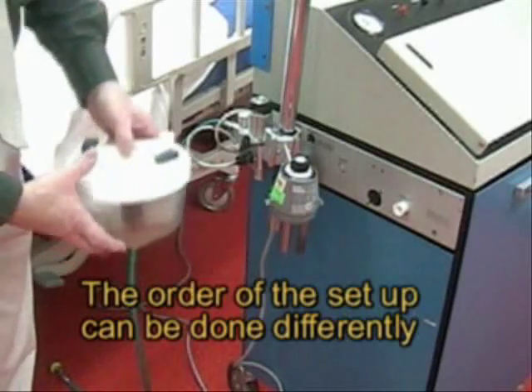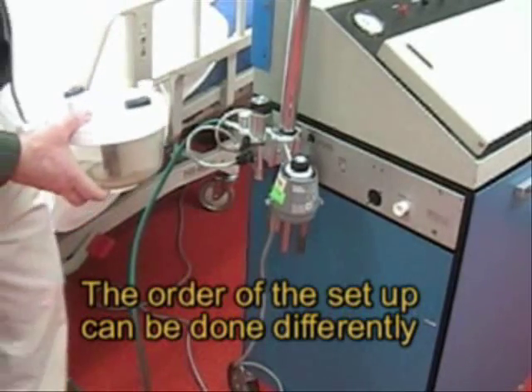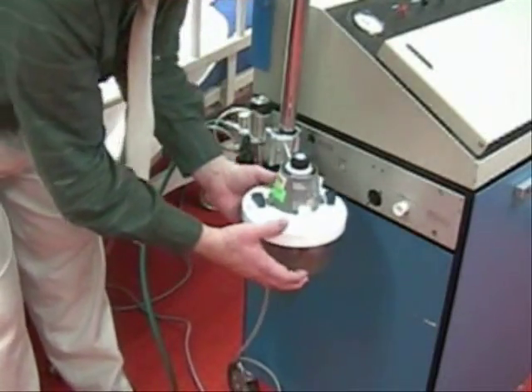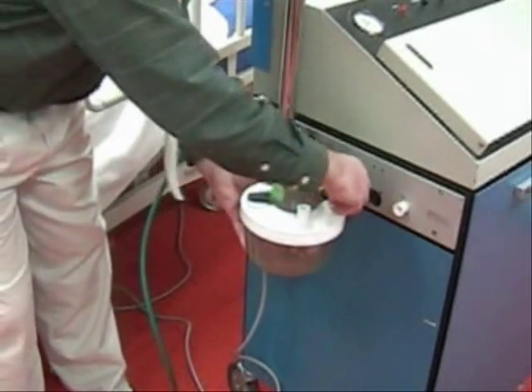The first thing we're going to do is place the humidifier on the cascade heating element and snap it into place.